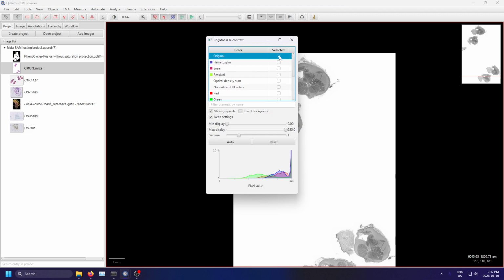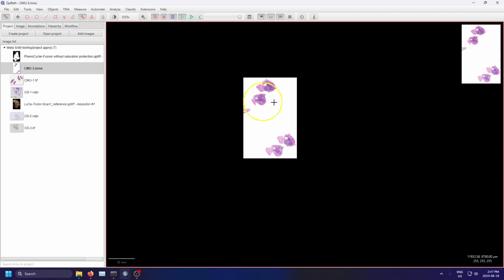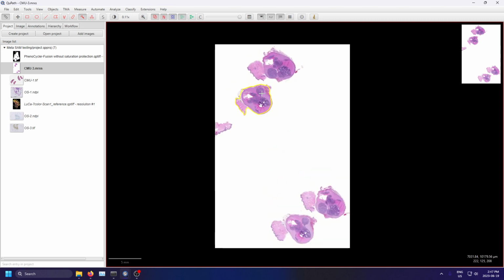Weird. There we go. We've got multiple tissue sections on the slide and we want them to be analyzed independently. Previously what you would do is use something like the wand tool at low resolution, not that low, and quickly contour your tissue sections. If we use SAM, well, it'll only generate one object at a time. So if we were to do these two things, I don't believe it would generate two separate objects. I forgot to restart SAM.